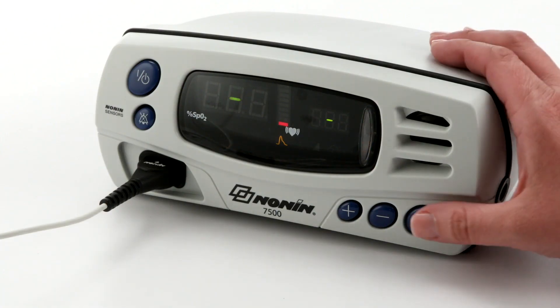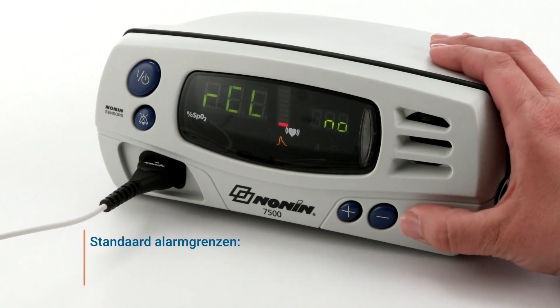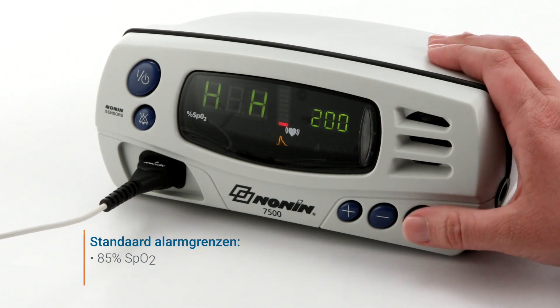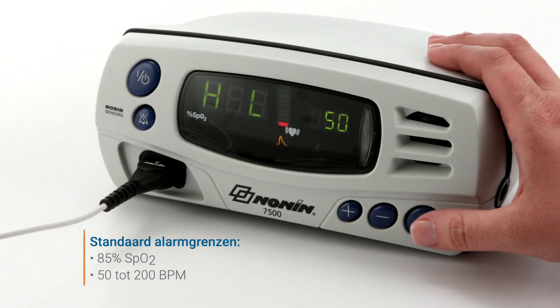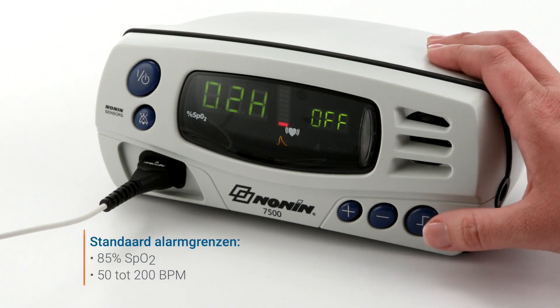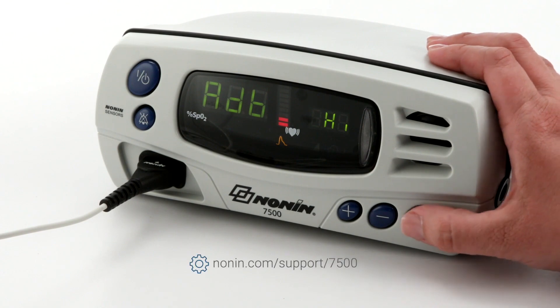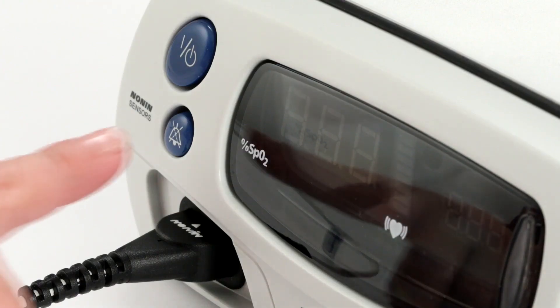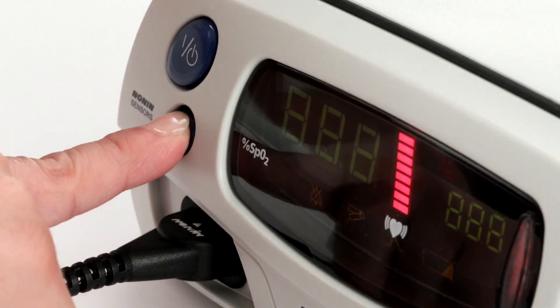It's recommended to set and check alarm limits and other oximeter settings prior to each patient use. The oximeter comes with a default low alarm setting of 85% SpO2, a low pulse rate of 50 beats per minute, and a high pulse rate of 200 beats per minute. These may be customized in the setup mode, explained in the operator's manual. A patient security mode may be set to prevent changes to alarm limits and other functional settings.